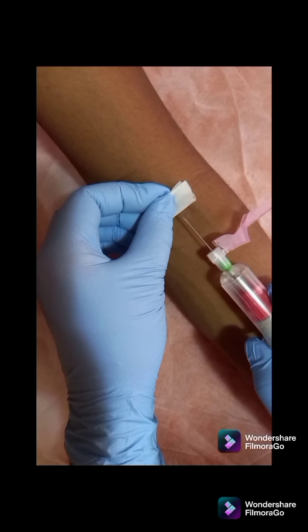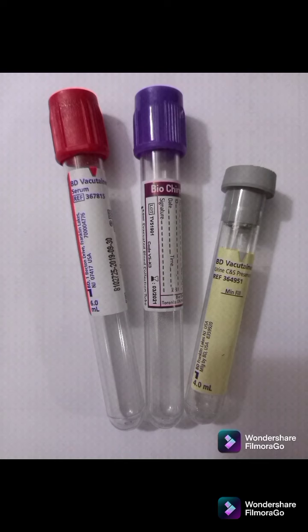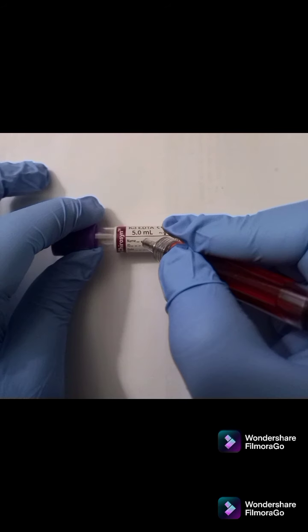Place a gauze over the venipuncture site and remove the needle. Activate the safety feature to prevent needle stick and apply pressure to the site. Dispose of sharps in the sharps container. Label tubes and observe special handling precautions. Check the patient's arm for signs of bleeding and apply a bandage. Dispose of other used and contaminated materials. Thank the patient, remove gloves in an aseptic manner, and wash or sanitize hands.